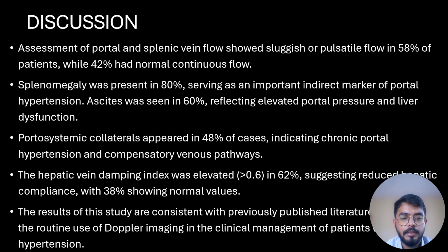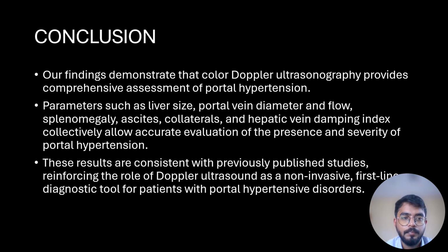The hepatic vein damping index was elevated, more than 0.6 in 62%, suggesting reduced hepatic compliance, with 38% showing normal values. The results of the study are consistent with previously published literature and support the routine use of Doppler imaging in the clinical management of patients with portal hypertension.